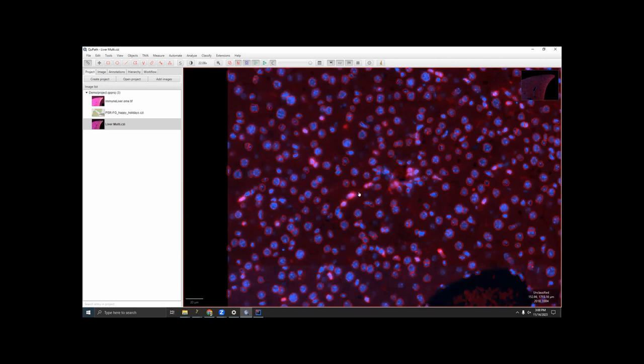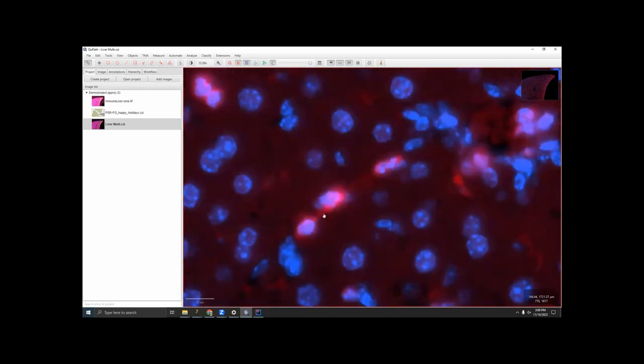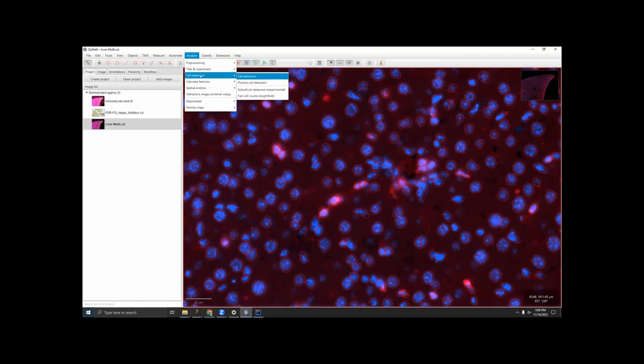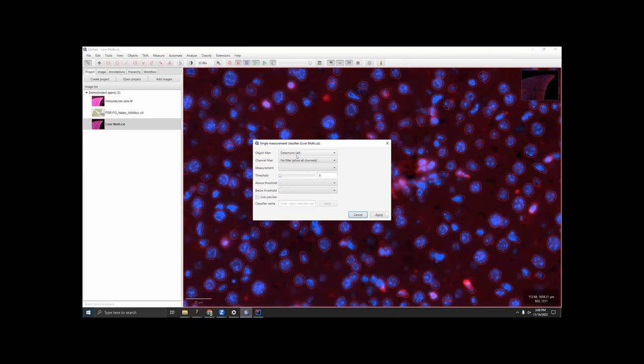I've already run cell detection. If we were to try to set a simple threshold to find the positive cells, we wouldn't be able to do it. Let me demonstrate what that looks like. I'm going to turn on cell boundaries. I'm going to try to make a quick threshold using just the cell AF647 channel.